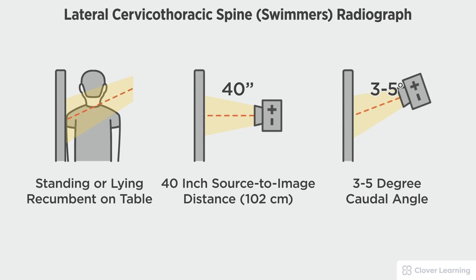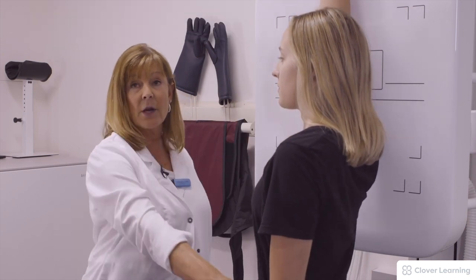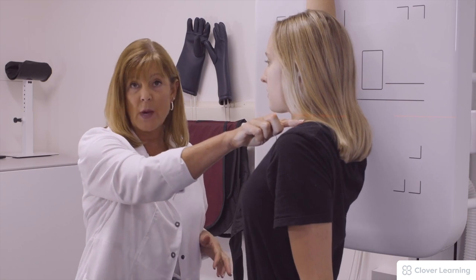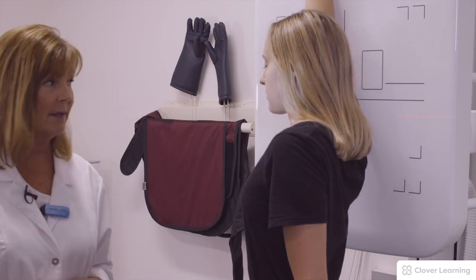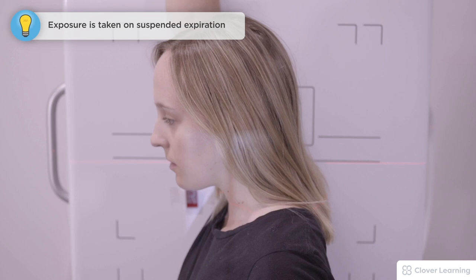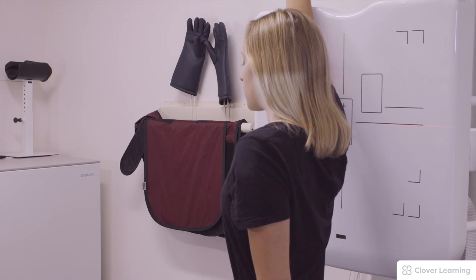If you are not able to visualize all seven cervical vertebrae on the cervical spine, a swimmer's view may be necessary to show the cervical-thoracic area. The patient will take her right arm and extend it up over her head, and the left arm goes behind her — almost like a swim stroke — offsetting the shoulders that were previously superimposed. We lower the central ray to C7 to capture more of the cervical-thoracic area, and if the patient is unable to depress their shoulder, a three to five degree caudal angle may be needed.